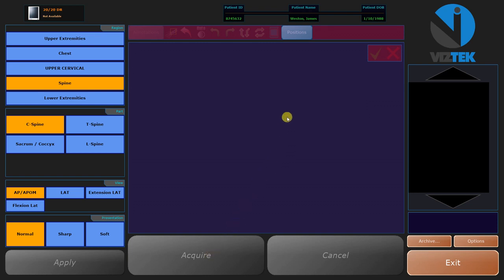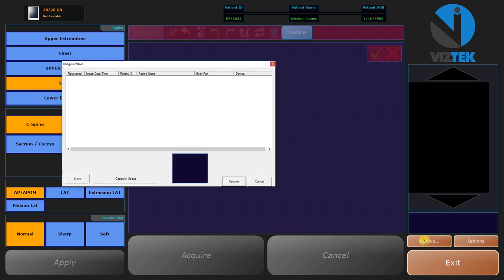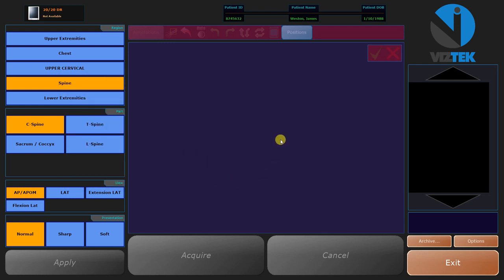Now, if you ever run into an issue with an x-ray not showing up underneath a patient, you can come back in to the acquisition side. Select Archive. And this will have the names of the patients and all the x-rays that you've taken. You would just select the x-ray and select Recover, and then it would load it in here like you had just shot it.